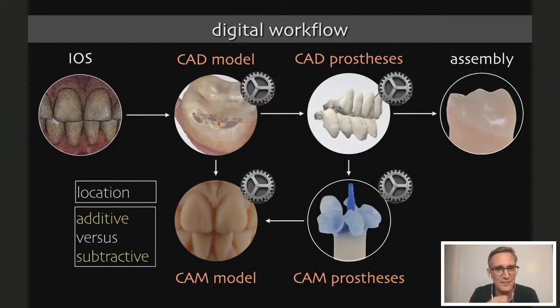So there are different options, and depending on where it's manufactured, maybe it takes more time because the crowns or the models need to be delivered. So yeah, there's a lot to understand within the digital workflow, which is quite different from the conventional. And I think that's very important, yes. Similar steps, but very different, and different areas where things can go wrong.